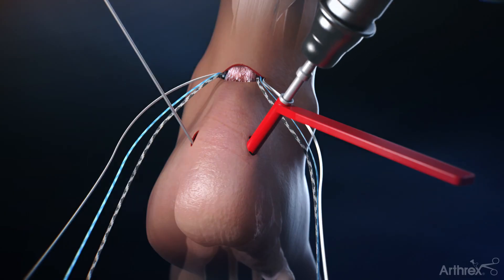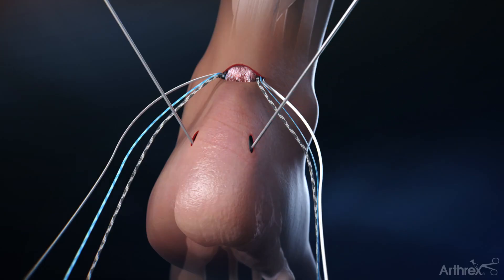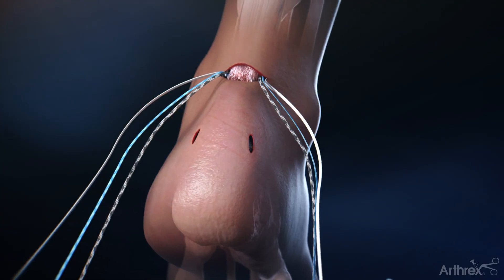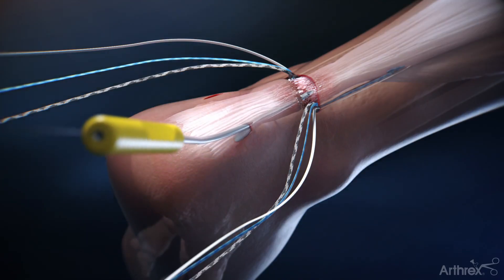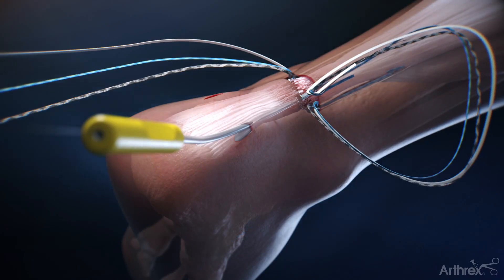These two holes are drilled with a 2.6 millimeter drill and tapped for later swivel lock insertion. A banana suture lasso is passed through the distal stump of the Achilles and out of the rupture site. The suture tapes from the proximal portion of the tendon are then passed through the distal stump and out of the stab incisions distally.